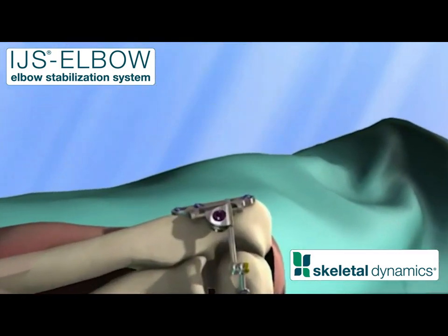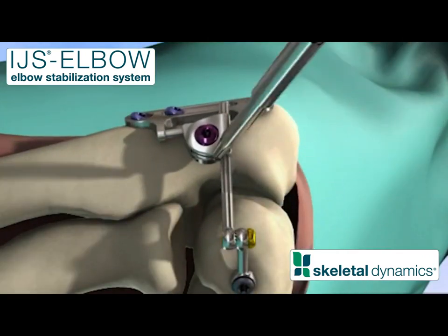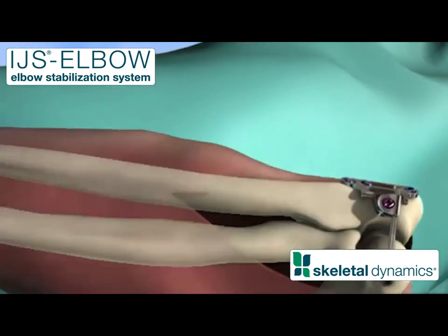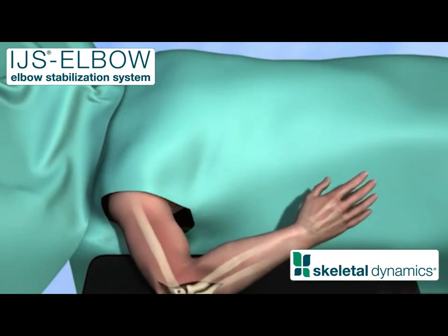Reduce the joint — placing the patient's hand upon their face facilitates reduction. Once the joint is perfectly reduced, tighten the humeral locking screw. Finally, tighten the ulnar locking screw. Test the patient's range of motion and confirm the proper relationship between the articular surfaces.